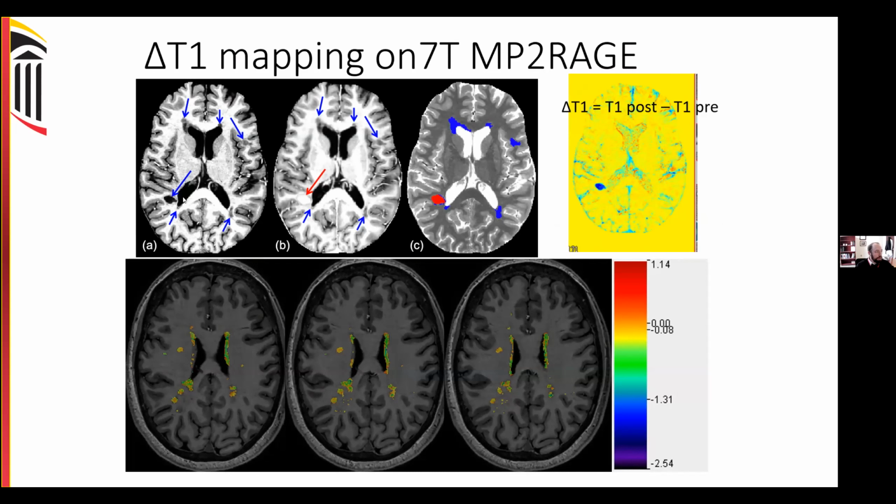And of course, not unexpected, you can see just visually that some lesions will be actively enhancing with contrast. So you see a lesion that's hypointense on the pre-contrast T1 weighted image, and then on the post-contrast T1 weighted image, that fills in completely with the gadolinium contrast agent. That's due to the T1 shortening that's happening, which could be represented also on the T1 map.